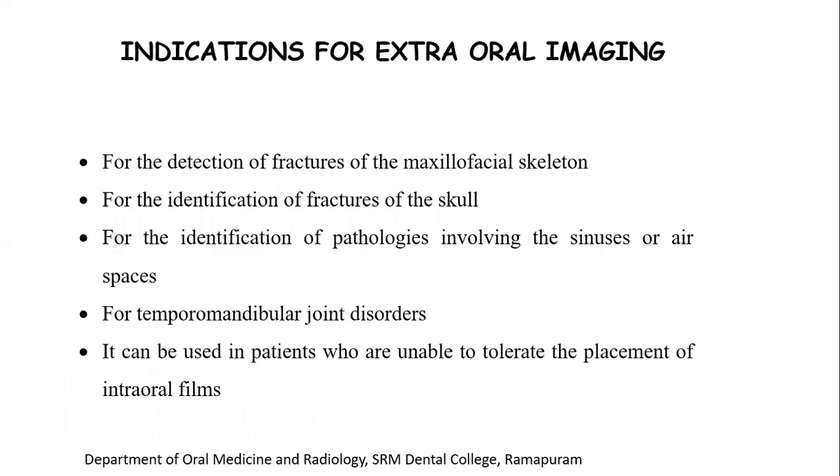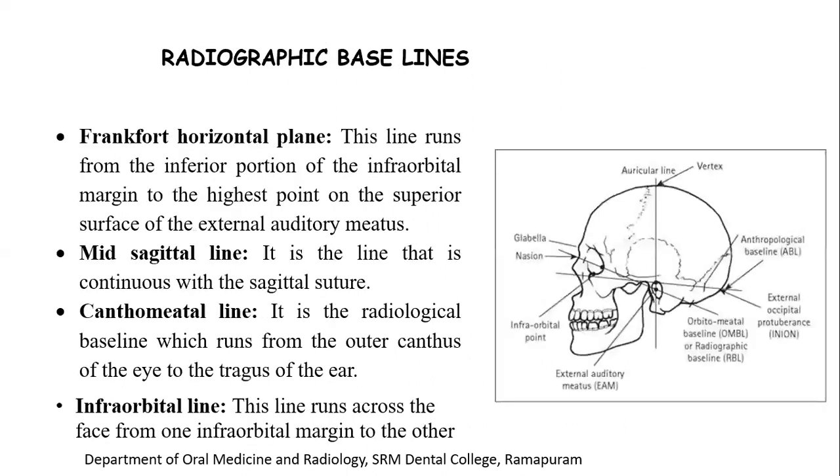So what are the indications for extraoral imaging? Extraoral imaging is mainly indicated for detection of fractures of the maxillofacial skeleton, for identification of fractures of the skull, and for identification of pathologies involving the sinuses or air spaces. As we all know, there are four pairs of paranasal sinuses, namely the frontal, ethmoid, maxillary and sphenoid sinus. It is also used for diagnosing temporomandibular joint disorders, and in patients who are not able to tolerate the placement of intraoral films, who have trismus or limited mouth opening.